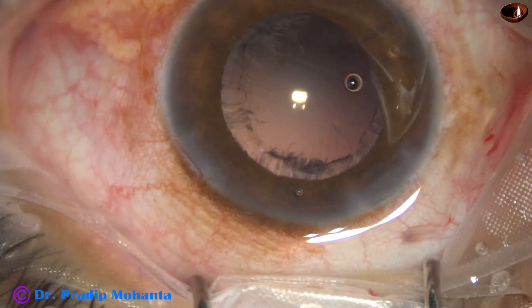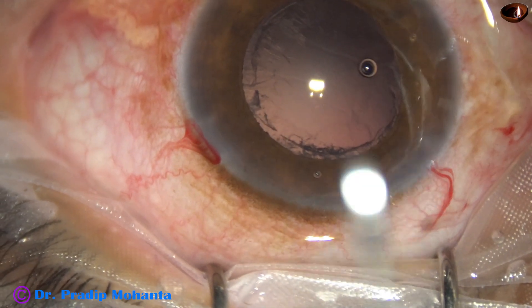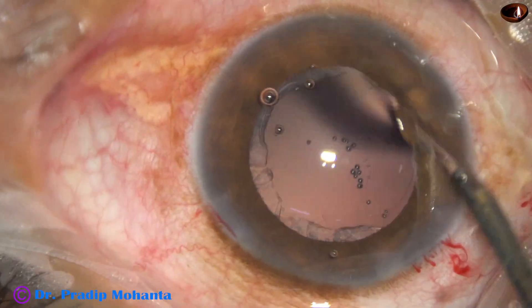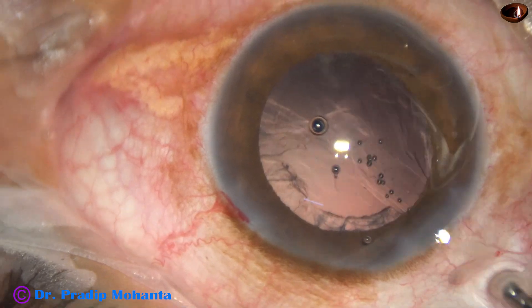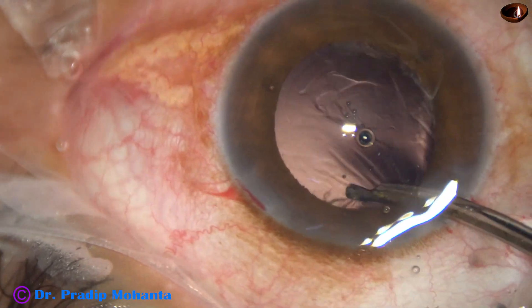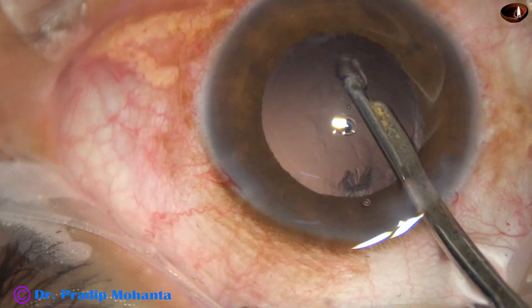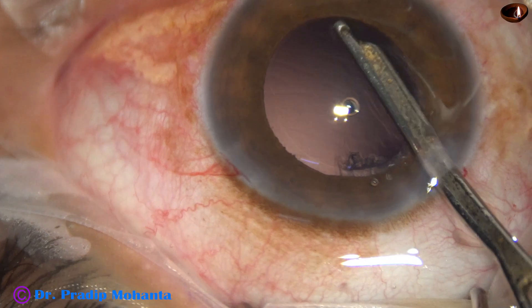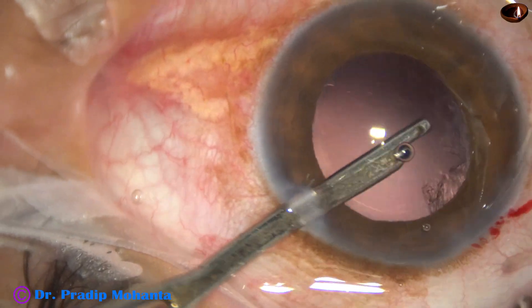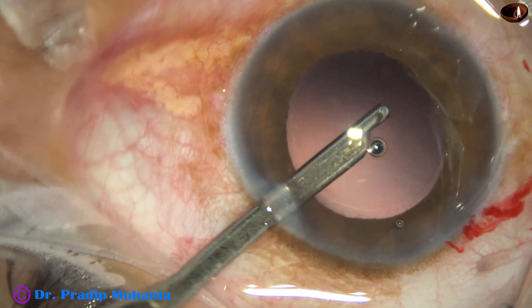Cortical cleanup is to be done. I inject viscoelastic and use a 23-gauge Simcoe cannula to remove the cortical lens matter. It is almost done. This is the cortex at 6 o'clock. This is the cortex sub-main wound, and the cortex from 10 o'clock is also removed.